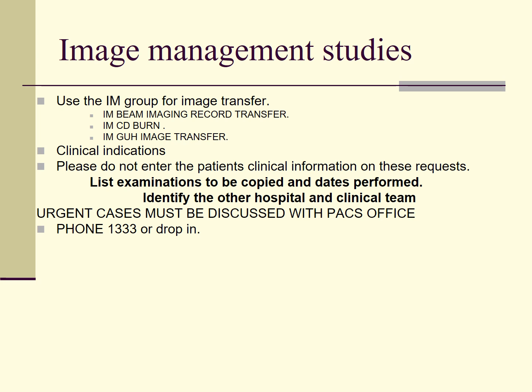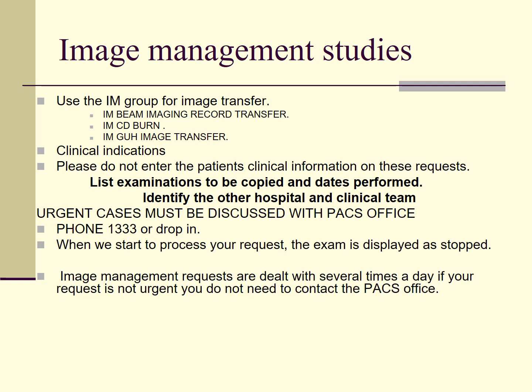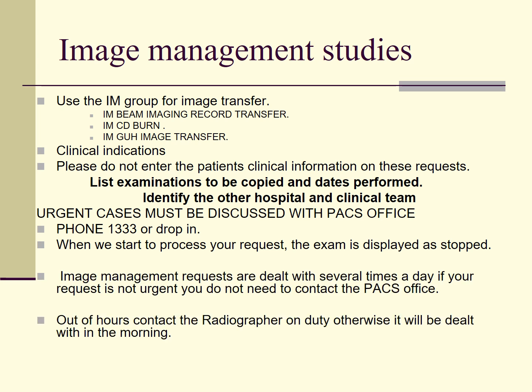Urgent cases must be discussed with the PACS office. Phone 1333 or drop in. When we start to process your request, the examination is displayed as stopped. Image management requests are dealt with several times a day. If your request is not urgent, you do not need to contact the PACS office.